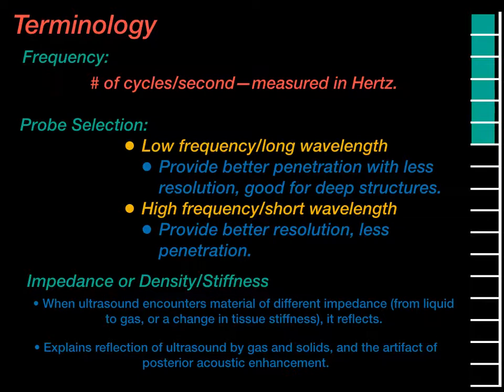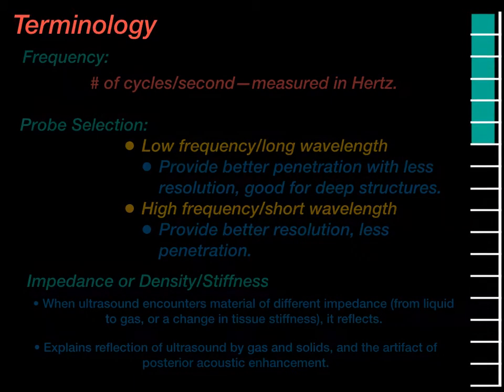An ultrasound works by producing a beam, and every time that echo is reflected back, a crystal deforms and vibrates, which generates another impulse and is then processed onto an image on your monitor. This becomes important because the propagation speed is different in different tissues.